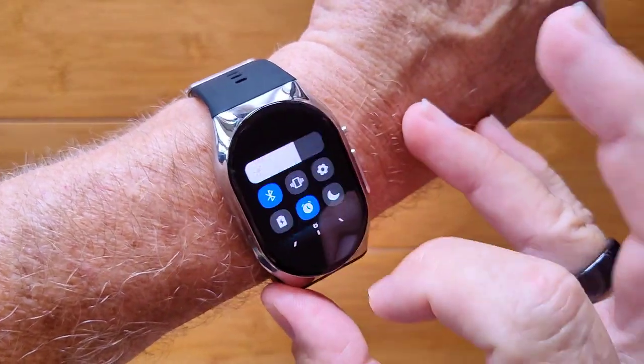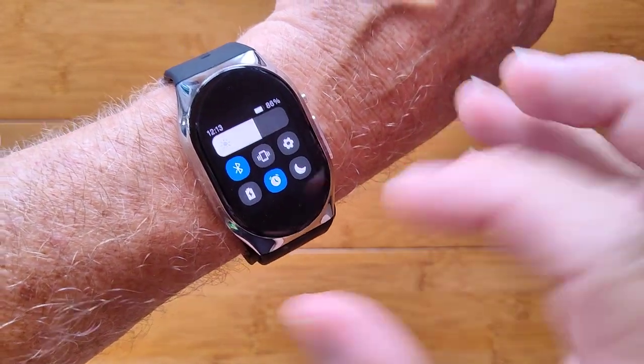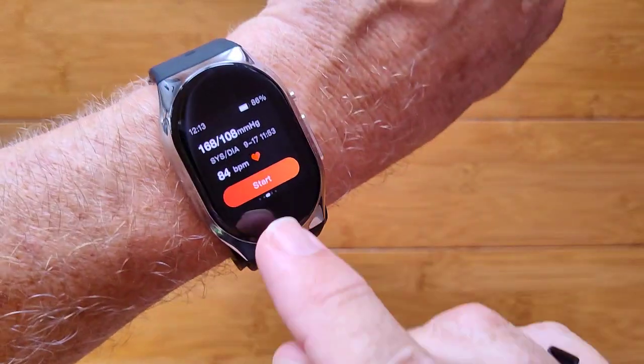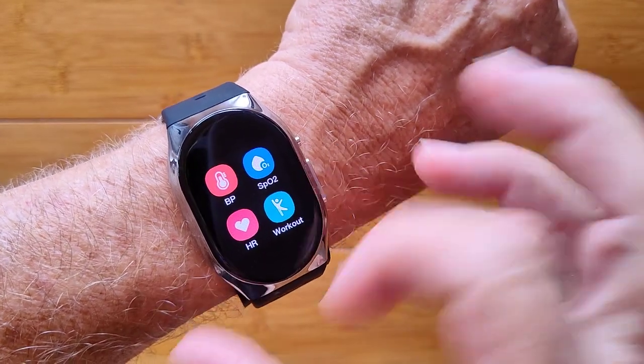In addition to the blood pressure reading, you have all kinds of controls — brightness, Bluetooth connection, finding your phone, alarms, do not disturb, all of that. You also have the blood pressure reading itself, heart rate reading, and blood oxygen readings available in this one too.